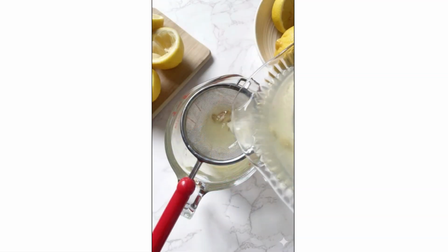Now think of making a lemon juice and pouring it through a filter. Now when you pour it, everything right from water, sugar, pulp and seeds, irrespective of their size, gets carried along by the water flow. Here, whatever goes through the filter gets transferred while the larger molecules stay behind.